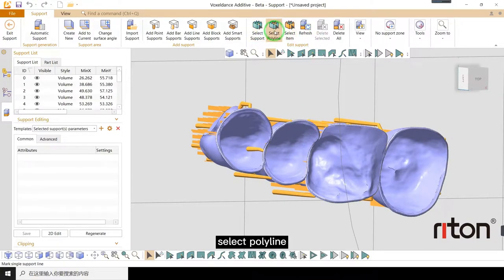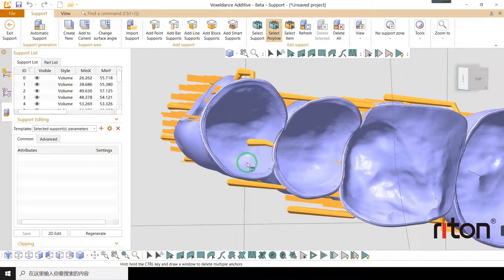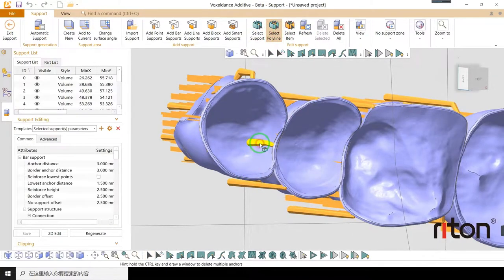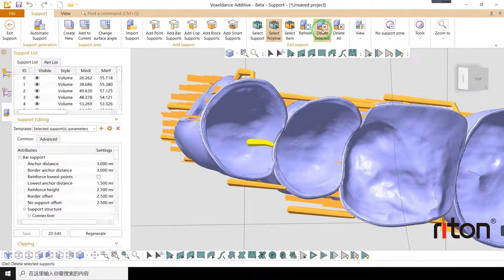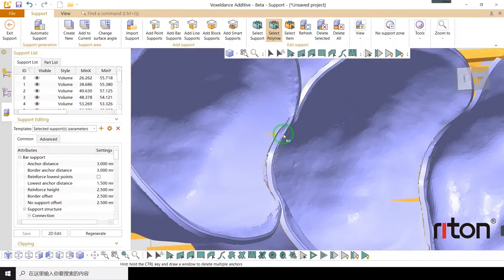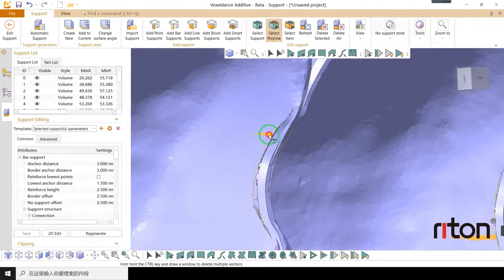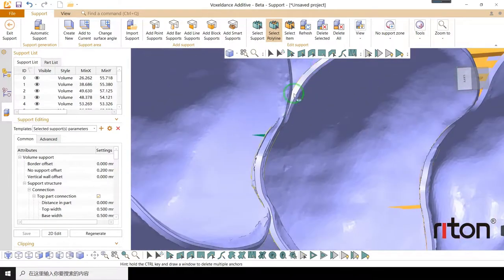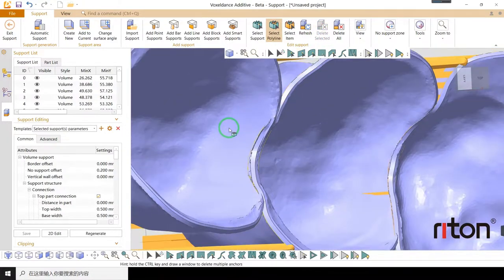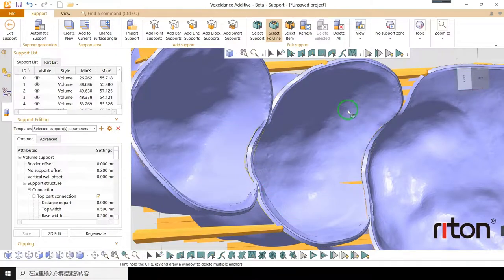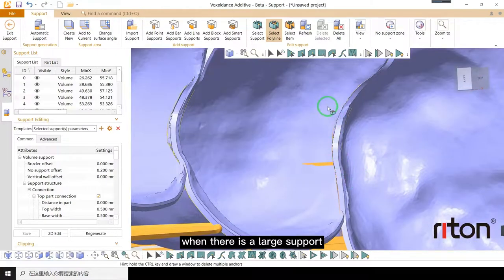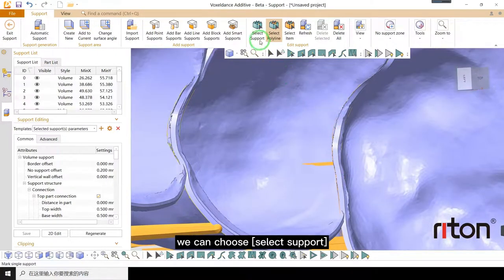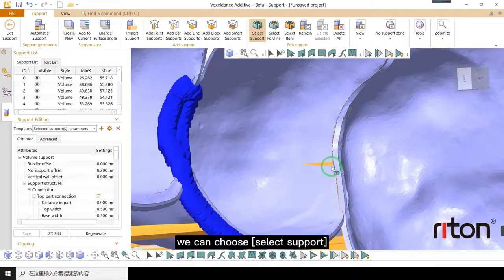Select polyline. Click the support and delete. When there is a large support, we can choose select support.